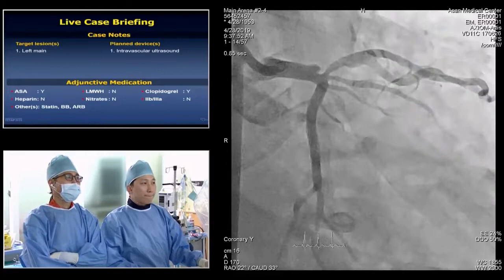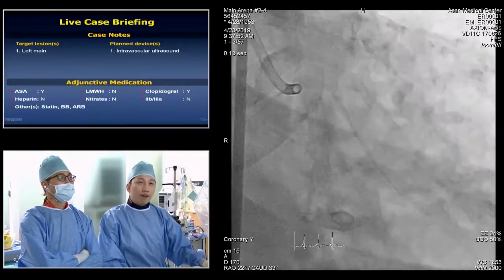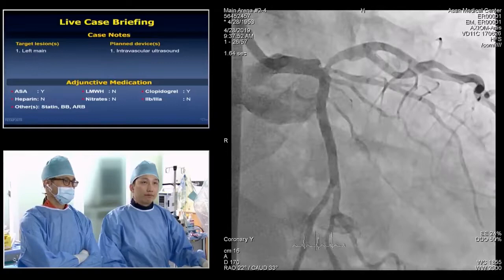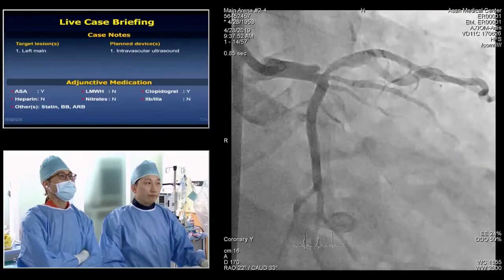Yes. And again, I think you'll see that disease extends into the proximal or ostioproximal LAD for about 10 millimeters. And the rest of the vessel will be pretty normal. If you look at the caliber of the ostioproximal LAD, you can see it's all generally narrowed. So in my mind's eye, I would extend the roof of the left main to the LAD, and you can see where that plaque probably used to be.